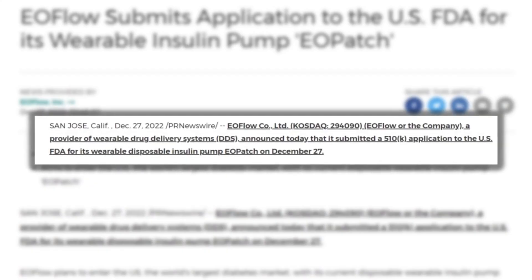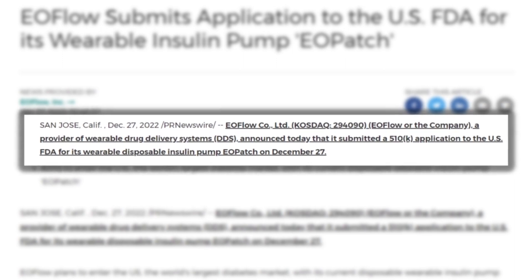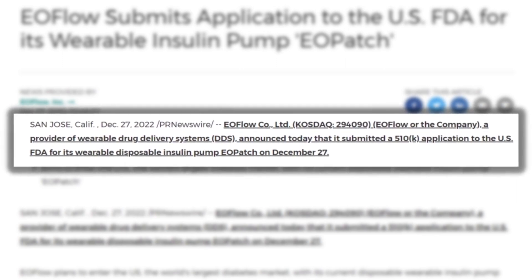It was recently submitted to the FDA for approval here in the US, and it's already out in Europe and a number of other countries. Today I wanted to go over the specs and talk about where this pump has some advantages over other tubeless insulin pumps that are on the market.